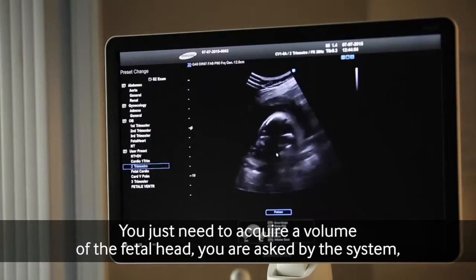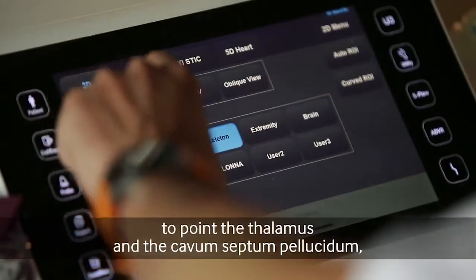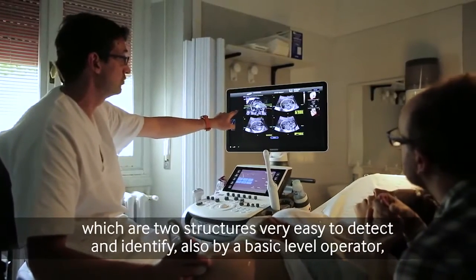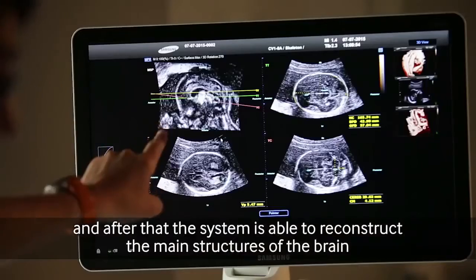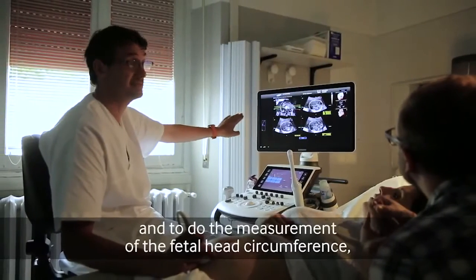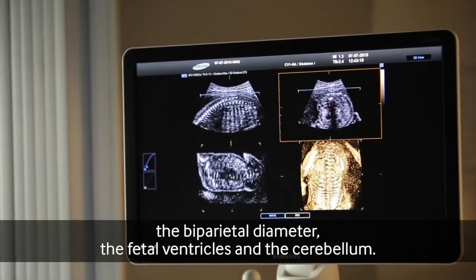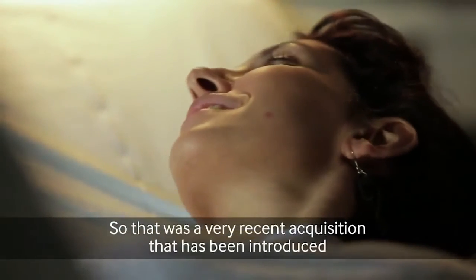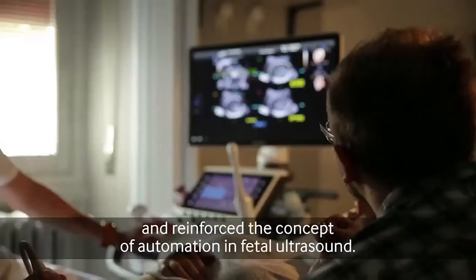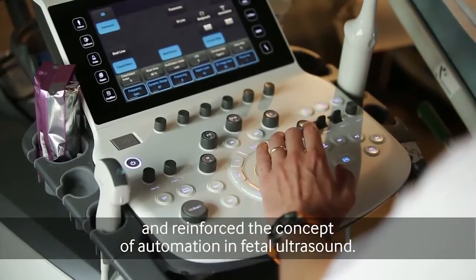You are asked by the machine to point out the thalami and the cavum septum pellucidi, which are two structures very easy to detect and identify, also by a basic level operator. After that, the machine is able to reconstruct the main structures of the brain and to do the measurement of the fetal head circumference, biparietal diameter, and the fetal ventricle and cerebellum. So that was a very recent acquisition that has introduced and reinforced the concept of automation in fetal ultrasound.